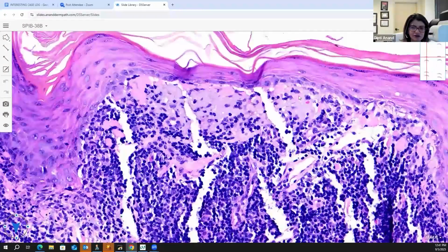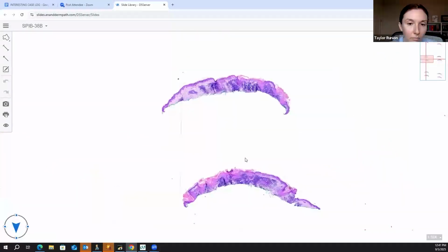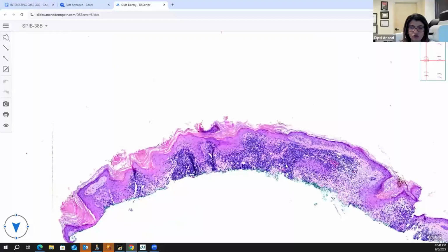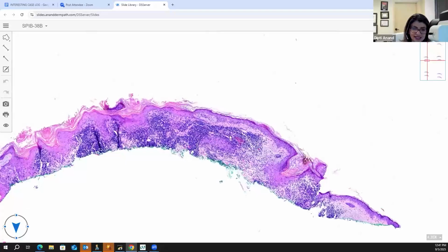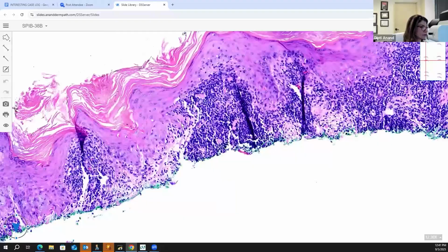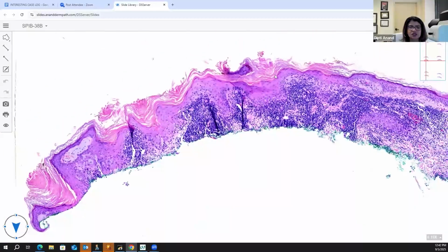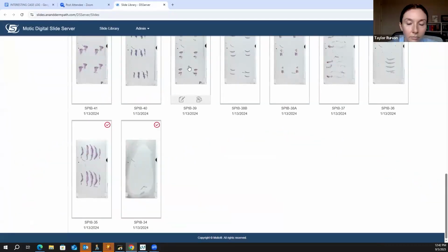So here you're seeing the very thick basement membrane, the epidermal atrophy, the follicular plugging. And with this degree of inflammation around the vessels and around the hair follicles on the face, you have to think about lupus. And as you said, they are beautifully plugged follicles. So any of the reactive changes which you can see over here, the thickened basement membrane and squamatization, this is also a plaque of DLE. Good job. Okay, let's go to the next one, which is 39.